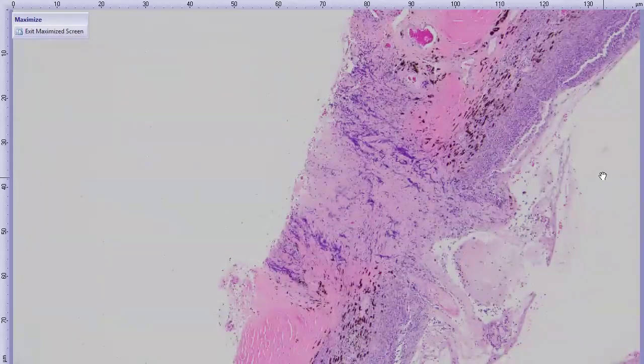And typically, we never see that purple streaming in other tortured optic nerves that aren't affected by neoplastic cells. Good point. The amount of DNA implies that there were more cells than we would expect at that site, basically. Fragility, yes, and fragile cells, actually also a good point. Round cell tumors like this one can be pretty fragile in particular and prone to exploding essentially, even with minimal tissue manipulation. The same is reflected in endoscopic biopsies with lymphoid tissue, where you see a similar effect.